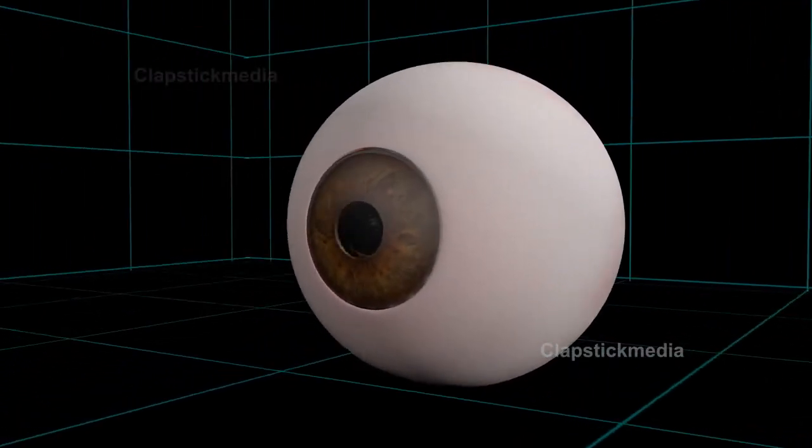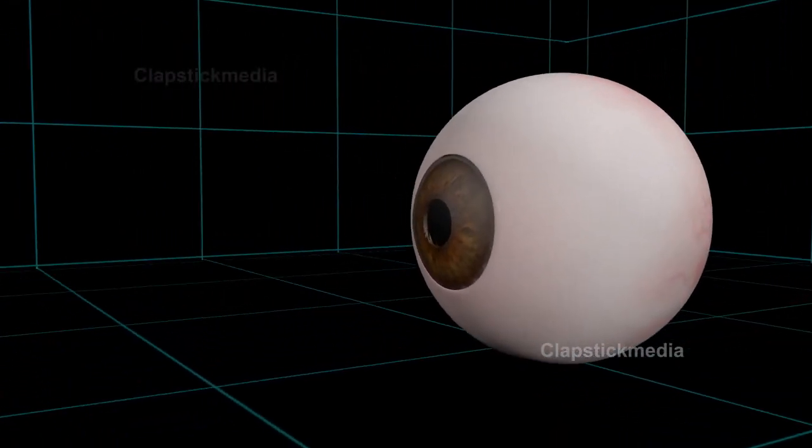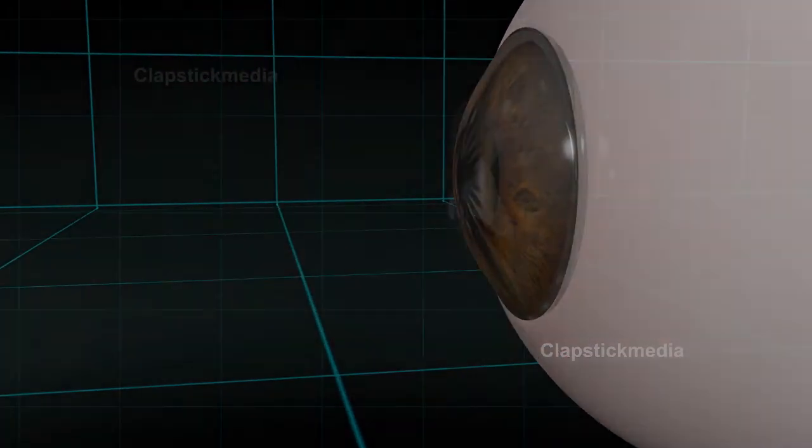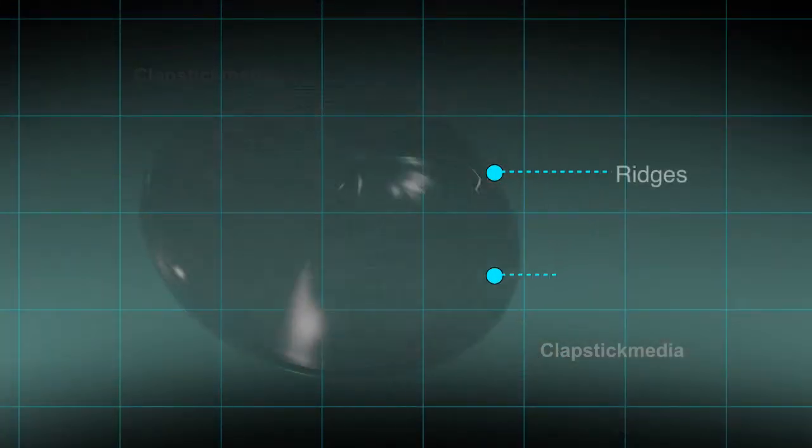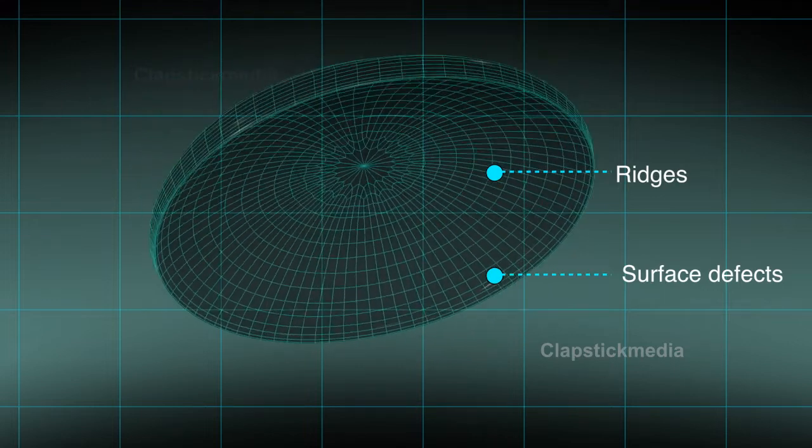However, once the cornea is damaged in such a way that it is no longer uniformly curved and has ridges or surface defects, then it can no longer be corrected with glasses or regular contact lenses.